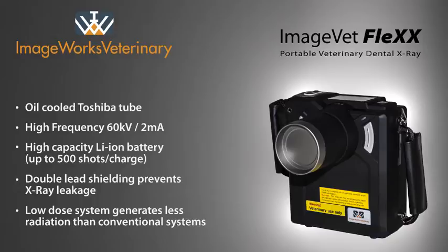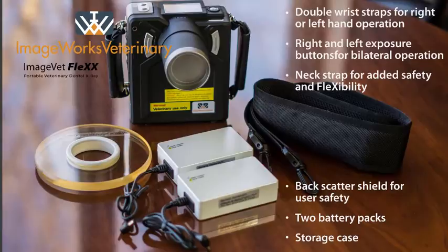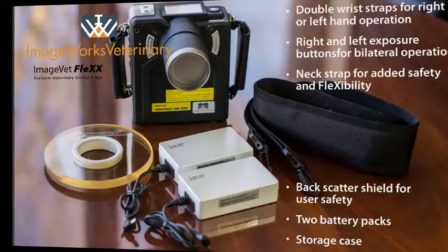The portable design can greatly reduce the amount of time it takes to perform a series of dental radiographs. Included with the system are the charging station, rechargeable battery packs, neck strap, and a hard shell transport case.